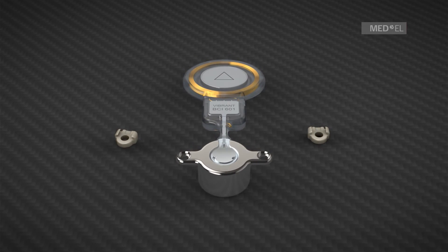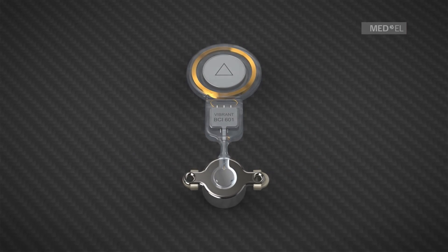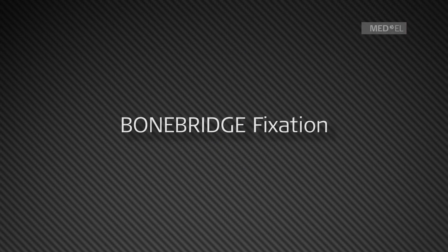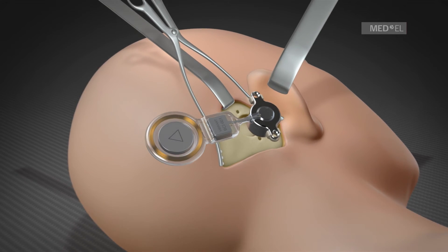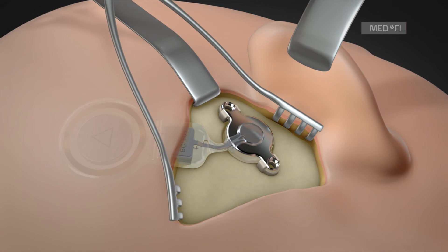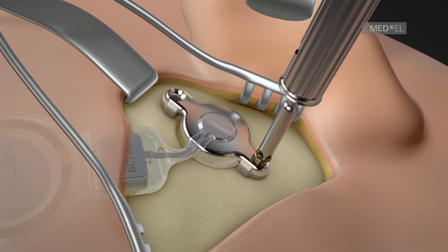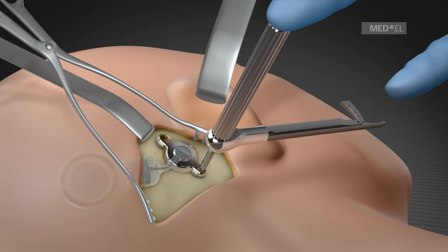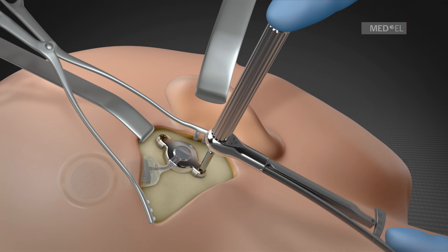Once the holes are drilled, the two millimeter BCI lifts are pushed onto the wings of the bone bridge FMT. With the appropriate screw lengths, the bone bridge is then screwed into the bone. Initially, they are screwed lightly into the fixation holes. With the torque wrench, the screws are secured firmly. A force of 10 to 20 newton centimeters is enough to ensure a tight fixation.